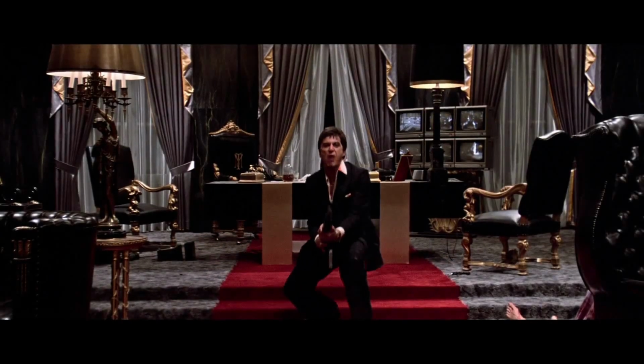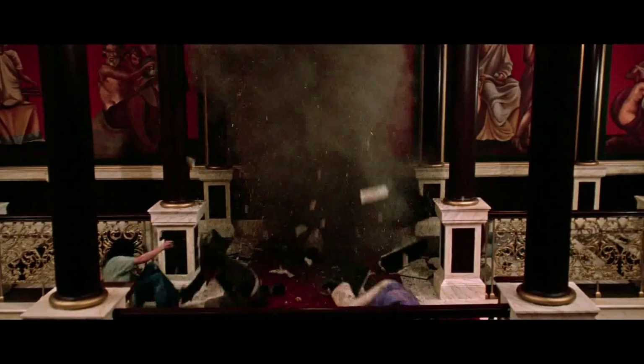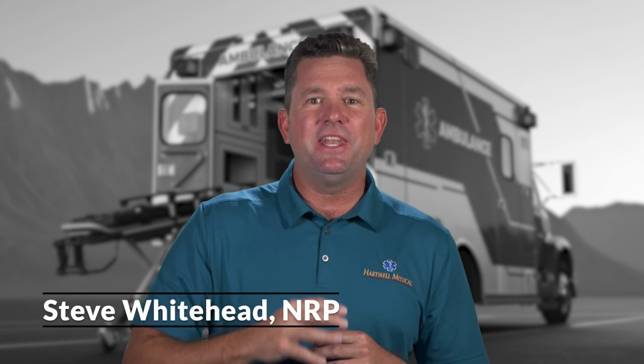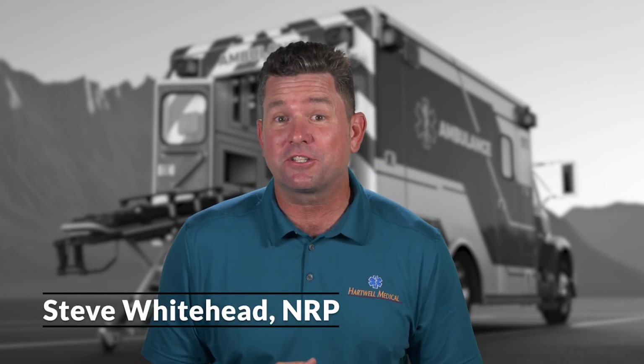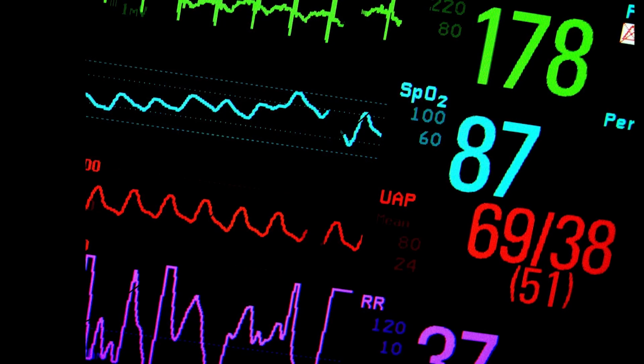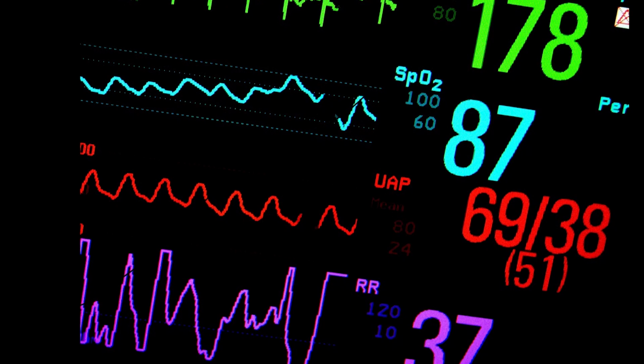In the words of the immortal Scarface, say hello to my little friend. And I'm talking about MAP, the mean arterial pressure of the patient. It's an innocuous little number that's been appearing on your monitor screen and essentially any automatic blood pressure cuff that you've ever used. The mean arterial pressure is basically the average of the patient's blood pressure throughout an entire single cardiac cycle.